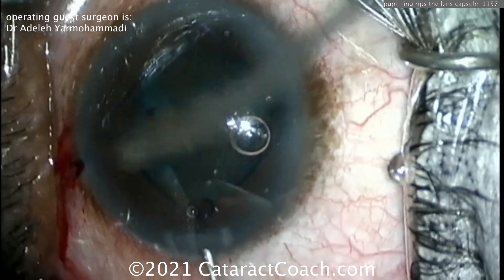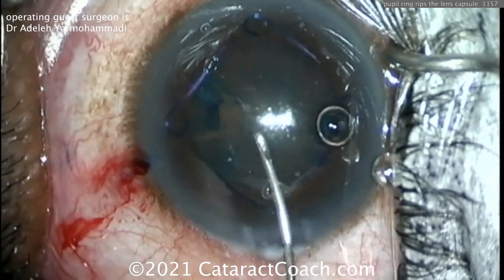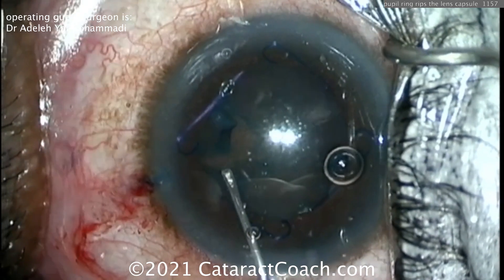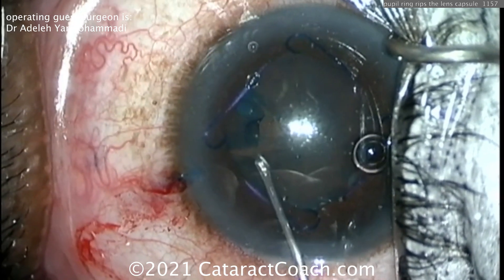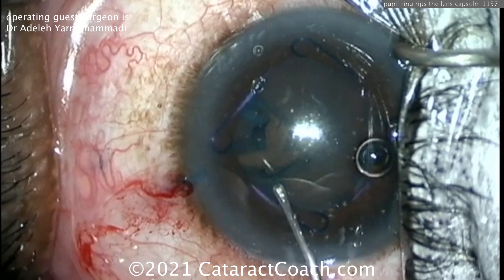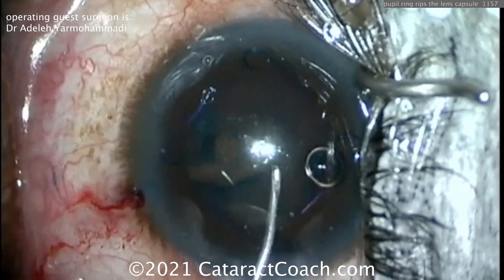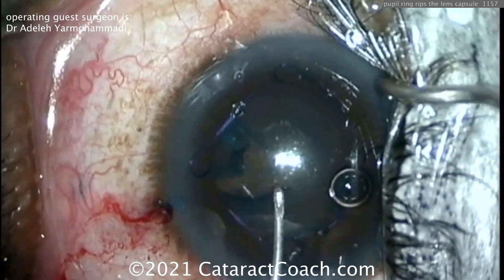The question now is: has it ripped all the way out to the zonules? If so, that's going to be more challenging — can a capsulorrhexis still be accomplished? I'd want to grab that capsule and try a maneuver to see if it can be brought in. You don't want those weak edges. It looks like the surgeon is trying to go the other direction to get the rhexis going the other way, pulling it over — but I'm not sure that's going to be successful.